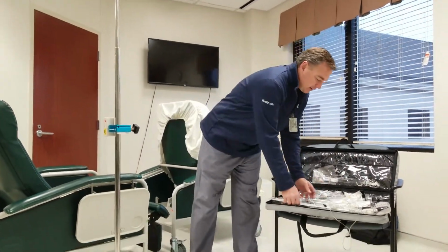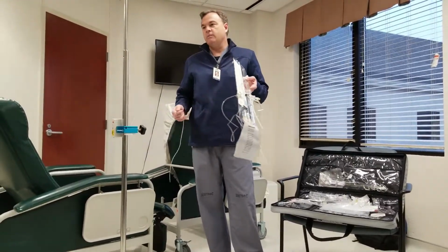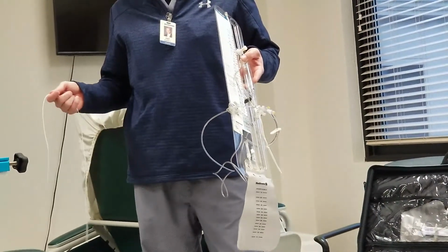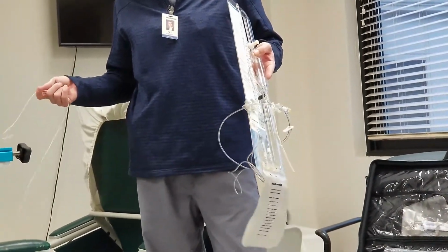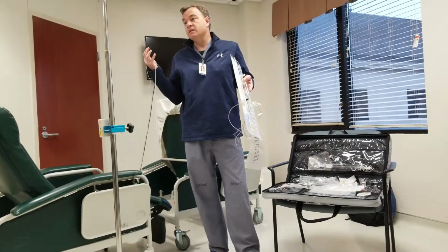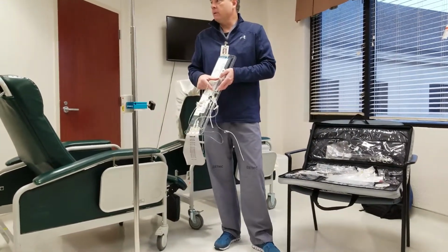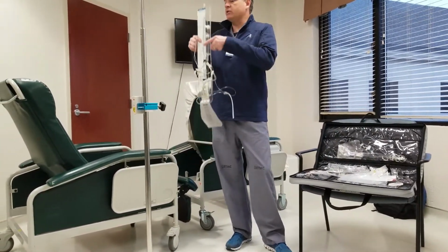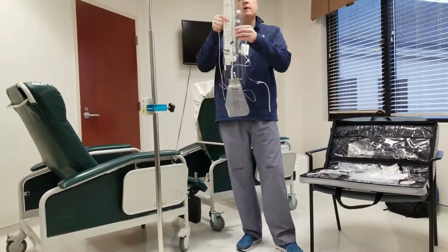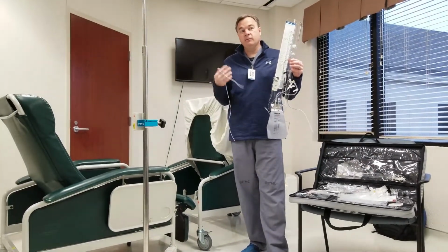This is what the drain looks like right here. And there's two ways to actually manage a lumbar drain, and it's going to depend on the surgeon. So that's another variable right there. There's a select group of people that just want to see volume, meaning a select amount of CSF over a time period. And then there's also people that will write the orders for a pressure setting, which is this sliding scale. There's a gradient scale here. What Dr. Pelosa wrote is what we're going to go over today, and then we can talk about the volume.